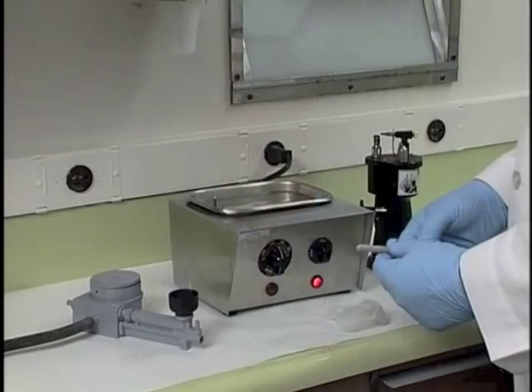So what we'll be needing to do is, with the compound, we will have a definite set 1, 2, 3, 4 type action that must go in the particular sequence. The one thing that I would like you to really remember, though, is that whenever you use compound, you never place that compound in the patient's mouth, or touch it with your fingers even, unless it is coming directly out of a 128 degree Fahrenheit water bath.